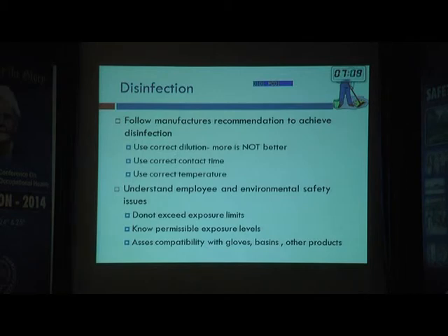So the most important thing is use the correct dilution. If it says use 2%, use 2%. Don't increase it. Just because you increase it does not mean that the effectiveness will be more. If they say use 70%, use 70%. Don't decrease or increase. And use the correct measure. Just don't use it like you're cooking, just put whatever you feel like and mix it. Because the concentration is very important. The temperature is very important. The pH is important. All the instructions, please read. Do not exceed the time. Just because you keep it for 30 minutes doesn't mean it will kill more than if you keep the recommended time of 20 minutes.